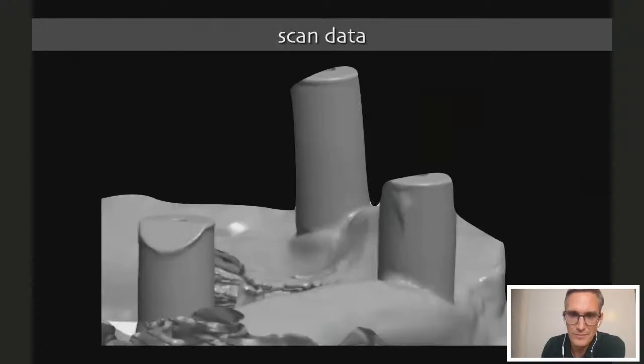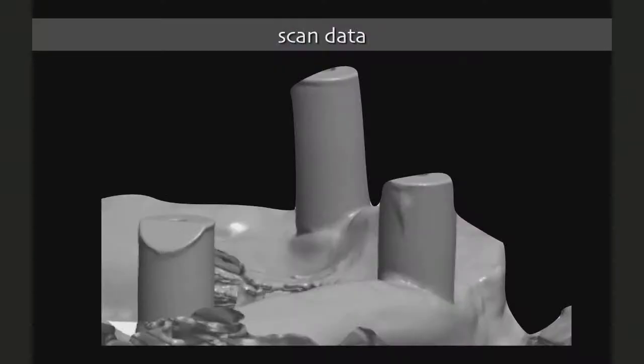And Sven, one quick question about that image that you're showing. Are these imperfections of the scanner or of the implant? What are we detecting here? Well, first, it could be the scanner, but it could also be the user who did not know how to, because there's always a scan path, and each scanner has its own scan strategy. As a user, you need to understand how your scanner works.